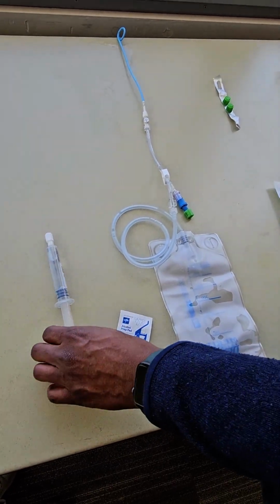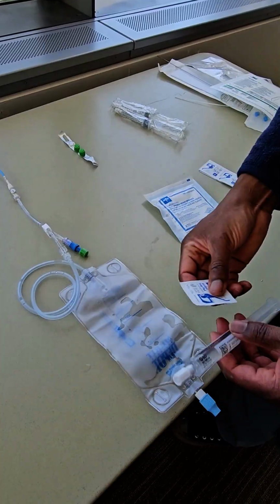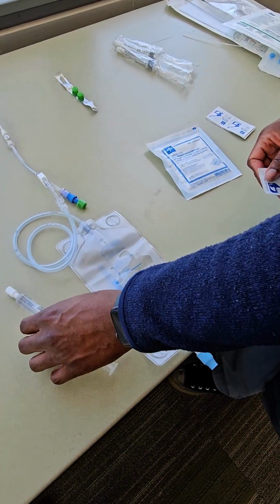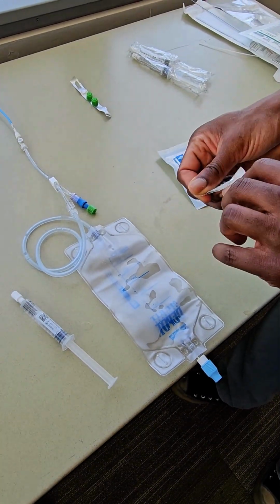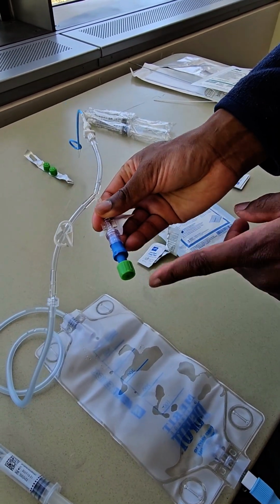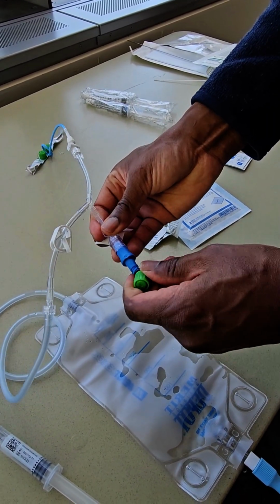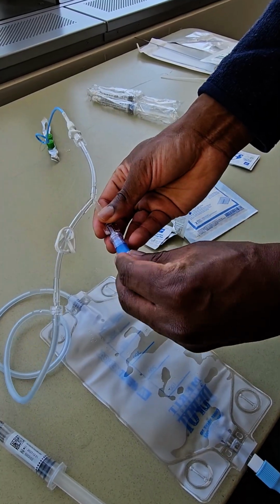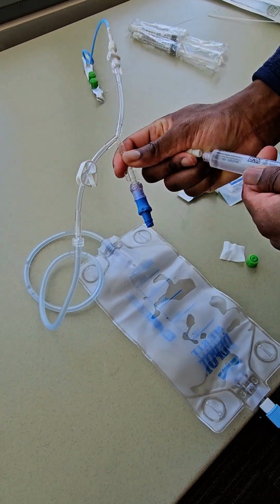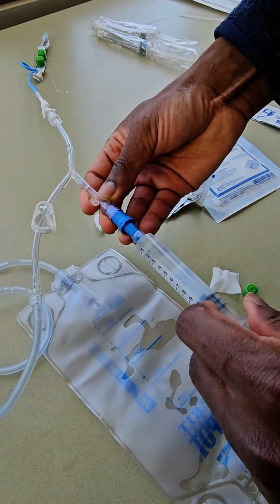So in terms of flushing, the tools that you'll need are basically a sterile saline syringe, about 10 cc's, an alcohol prep pad, some gloves or hand sanitizer. And the first thing that you would do is sanitize your hands. And then you'll basically take your prep pad and work on your flushing mechanism here, which consists of a blue clave and sometimes a green cap. And the goal is to keep everything sterile while you're doing this. So what you'll do is you'll unscrew the green cap and you'll clean the clave with some alcohol. And then you'll take the 10 cc saline flush and attach that to the blue clave. Sometimes what you have to do is push a little bit because there will be some resistance there.